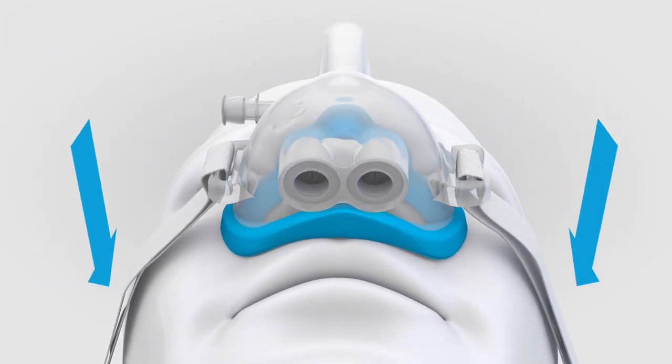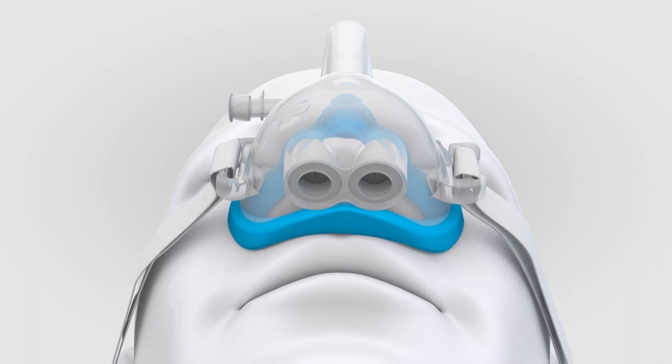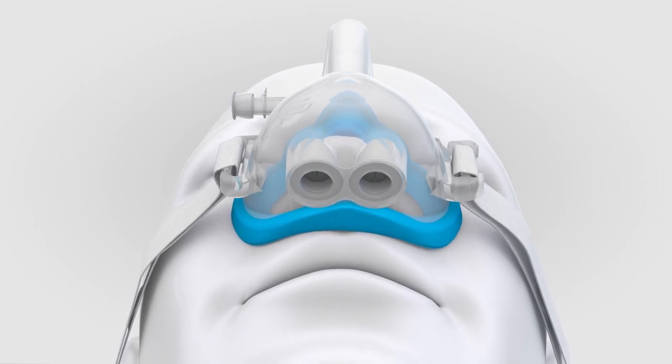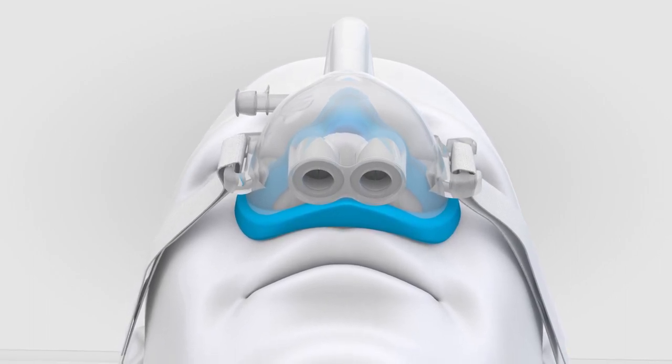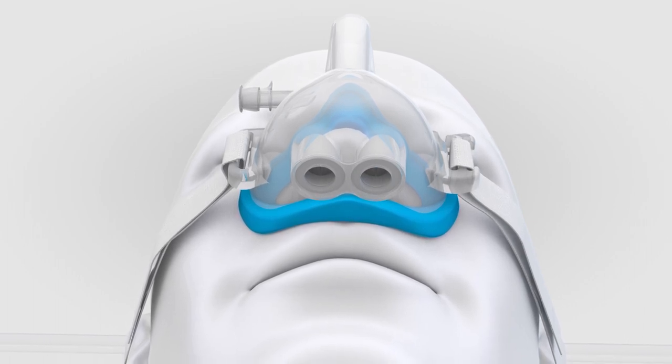Tighten the straps bilaterally to ensure there is no leak. Keep in mind that the tighter the mask is secured, the higher the achieved pressure will be and adjustments throughout the procedure may be necessary.